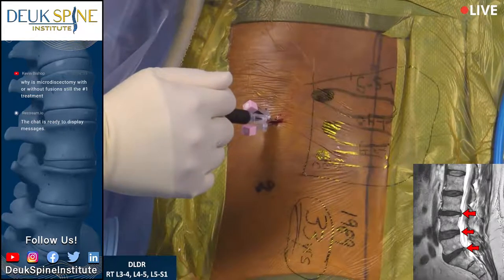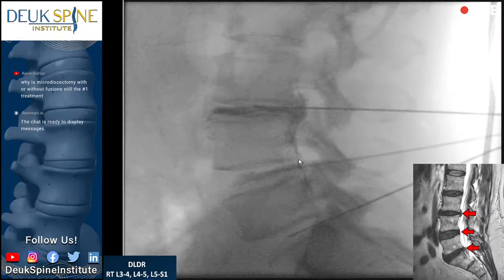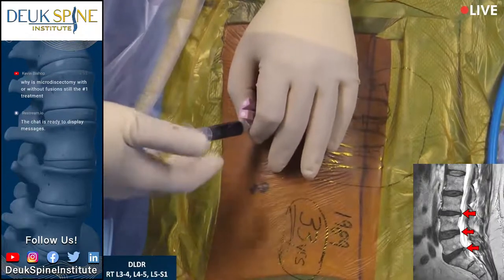How bad is that on a scale of 1 to 10? 10. Is that where you typically get pain? Yes. All right, so again, 10 out of 10. And what's interesting on this one is you don't see a lot of dye in there. That's concerning. That tells me there's probably a lot of scar tissue from inflammation. Yeah, so we'll still fix it. But it just indicates that that has been going on for a long time. The more scar tissue we see, the longer the problem has been there. And we already know from his history, he's had this back pain for 33 years. This poor man, his quality of life has literally been robbed from him for 33 years for something that's so fixable and easy for me to fix.